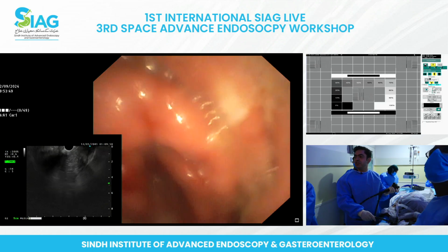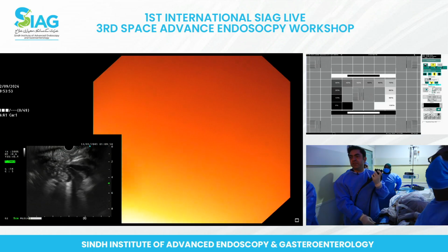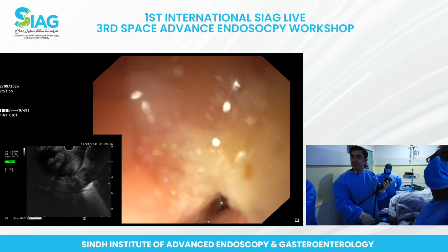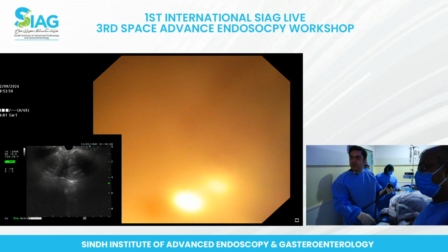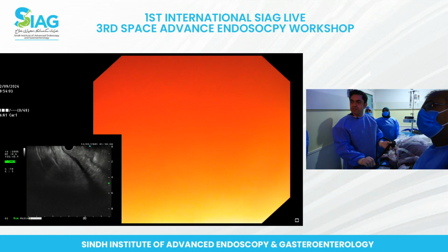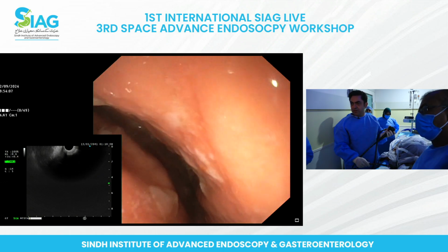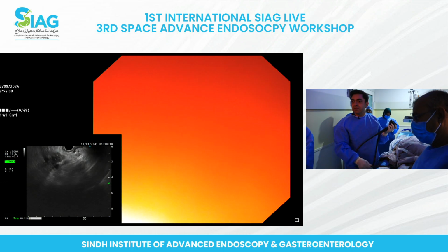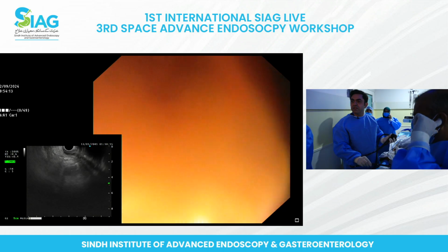Can't seem to appreciate any there. I'll just see in the mid-stomach area if there is anything that we can. Not in that area as well. No.